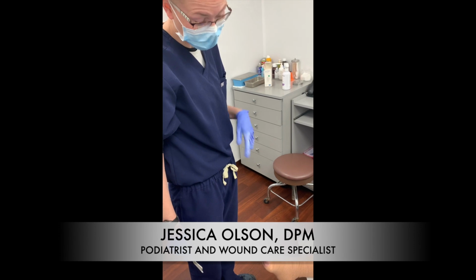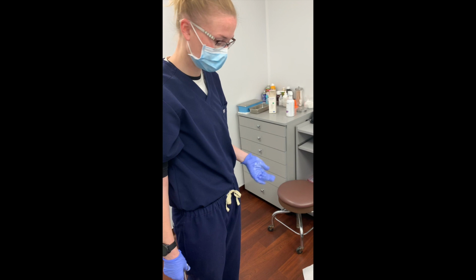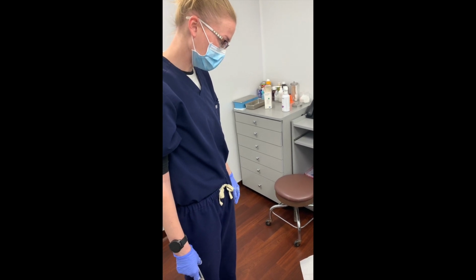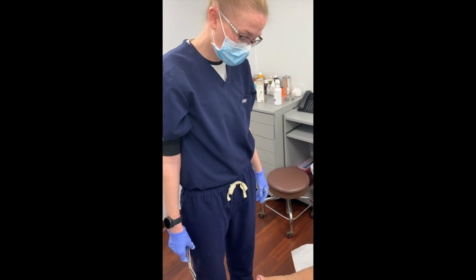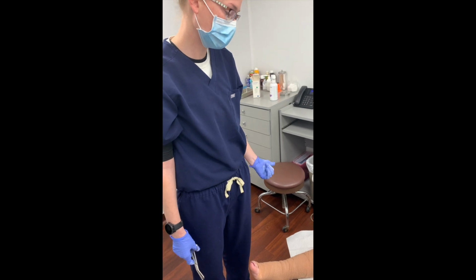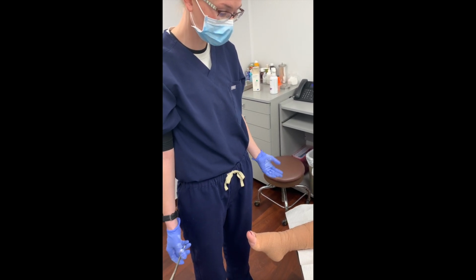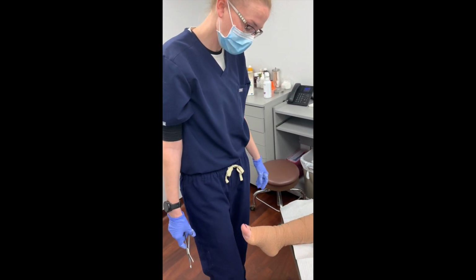We just went over how to put on an UNNA boot, and the other component of that is when your patient comes back, either in a few days or a week, how to appropriately take it off without injuring the patient. Again, our patient population is primarily wound care based, so you want to be cognizant of the nature of their skin, whether it's arterial disease, venous disease, systemic disease. A lot of patients don't have the healthiest of tissues, so even a nick of the scissor can result in a pretty severe wound. So be mindful of that.